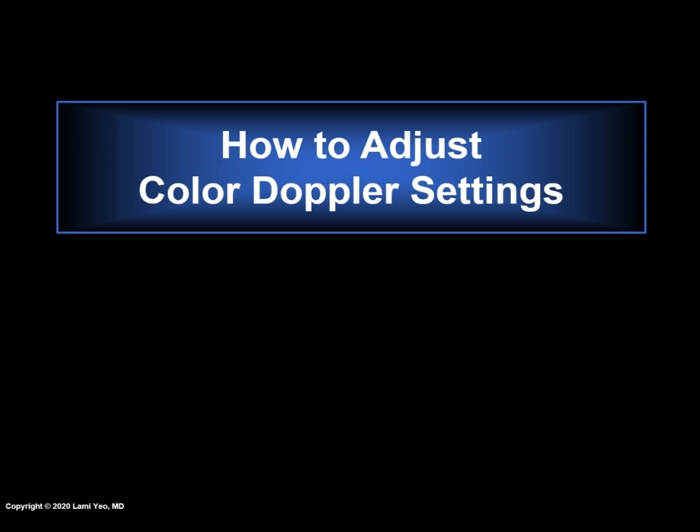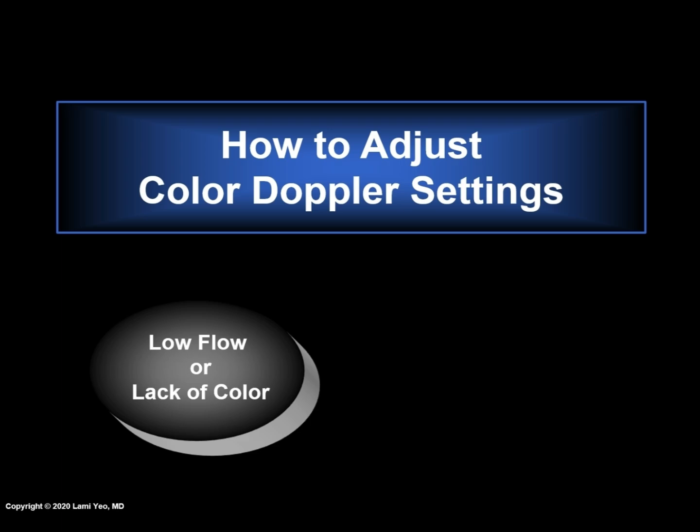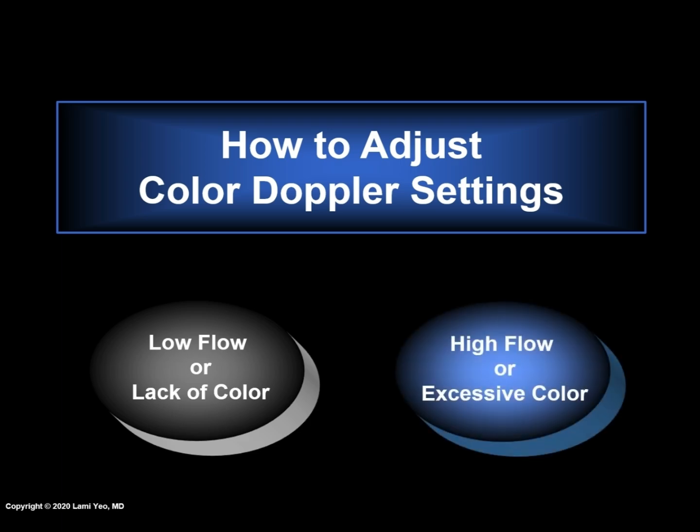Now let's review how to adjust color Doppler settings when imaging the fetal heart, depending on whether there is low or high color flow visualized.